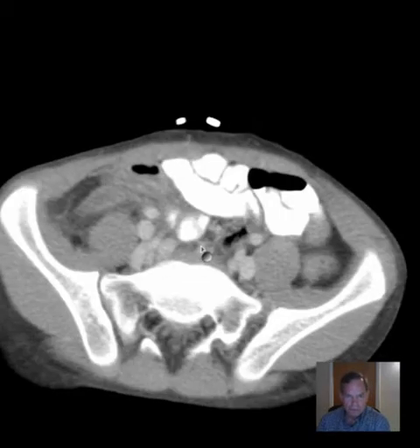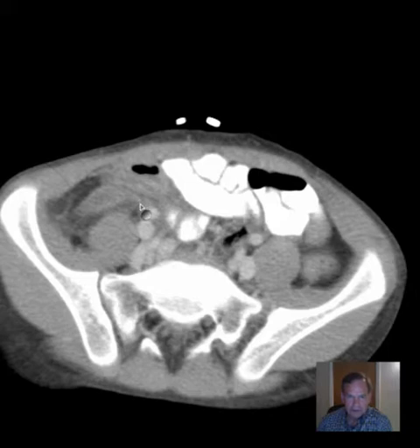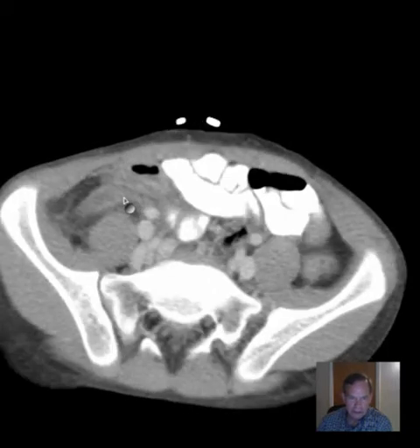Urinary bladder appears unremarkable. Here's the rectosigmoid colon. So whatever is the problem? Well, we want to look in the right lower quadrant because we have a clinical history that's very suggestive of appendicitis.